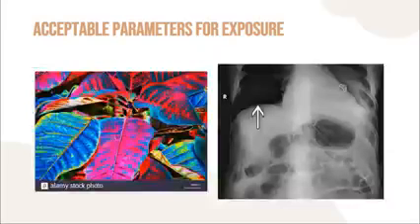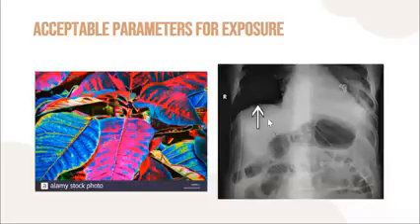For example, here, the image is saturated, but what I mean by saturated is that it is burnt. The colors are too much of a short scale. It looks like this when the patient is overexposed. Although your image looks good in some areas, there are areas that are oversaturated. Like this one, the lung markings are not visible anymore.